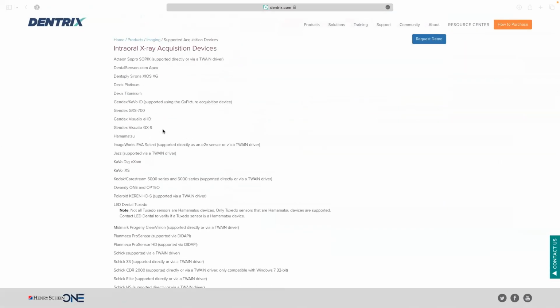Yeah, so here's a list. This is a list because of our Dentrix Ascend and Dentrix Imaging products. It's all listed there.